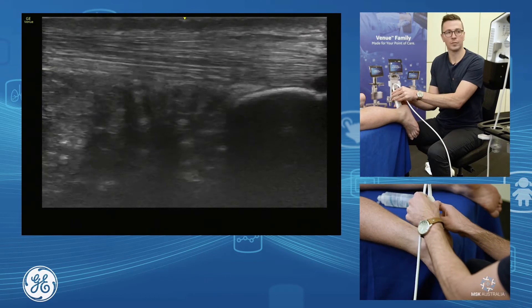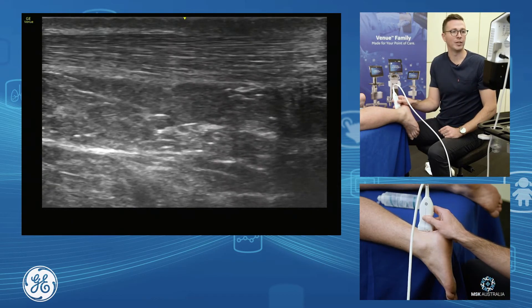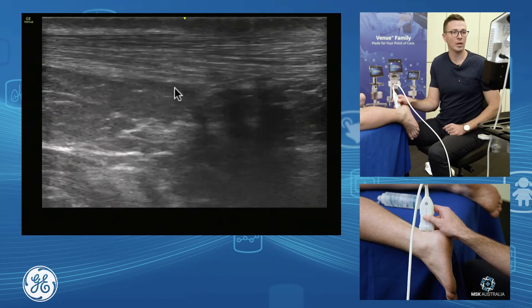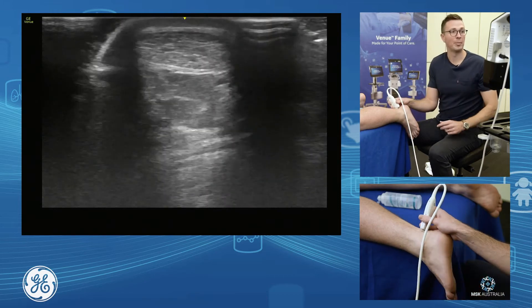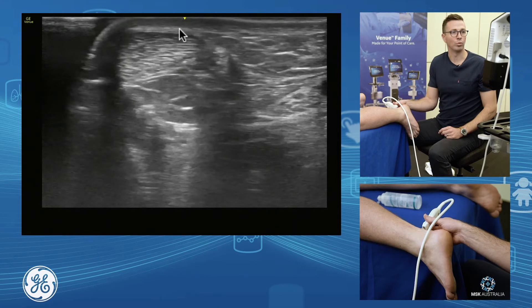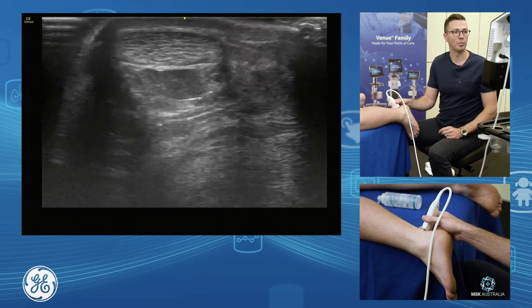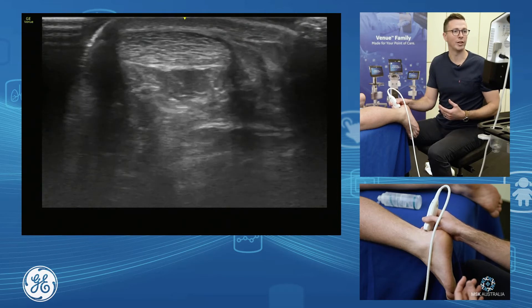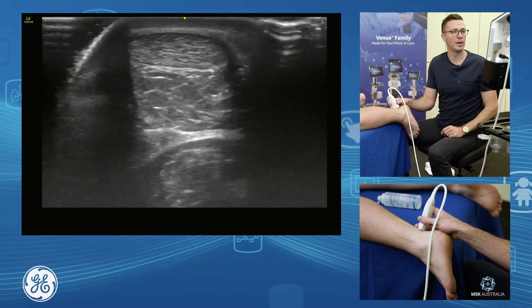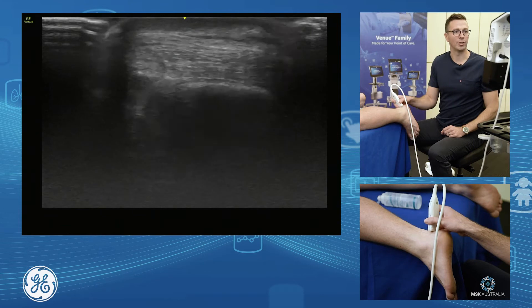More commonly you have your mid-belly Achilles tendinopathy, and with mid-belly Achilles tendinopathy you assess for Kager's fat pad underlying. Often adjacent with this, you have paratenon thickening as well. To assess the paratenon, you can roll your probe from one side to the other of the Achilles to try to highlight and pick up the retinacular of the paratenon — the paratenon can be thick and fibrotic. We also assess for fat pad and for retrocalcaneal bursa.